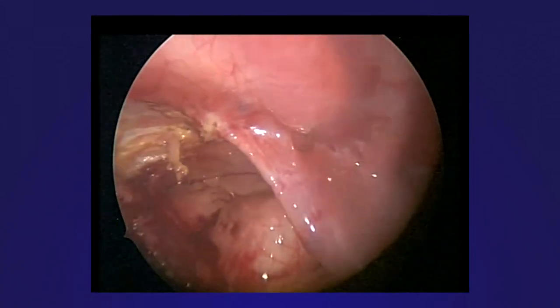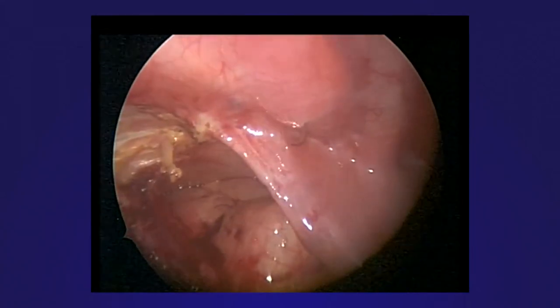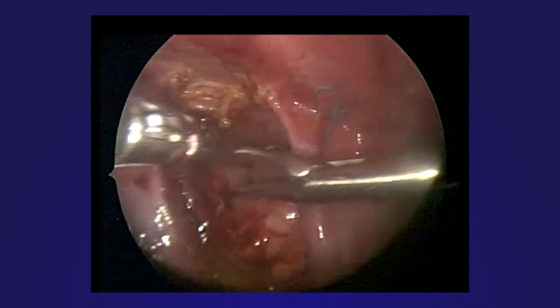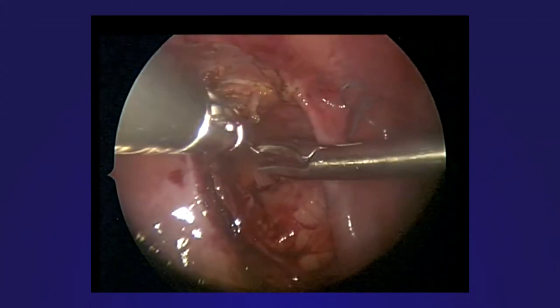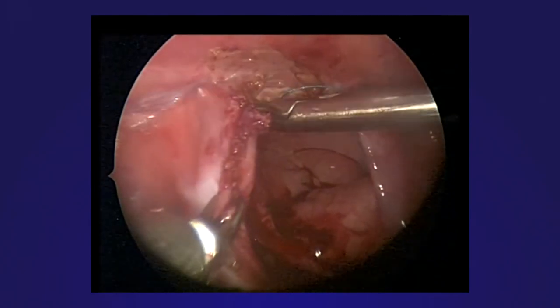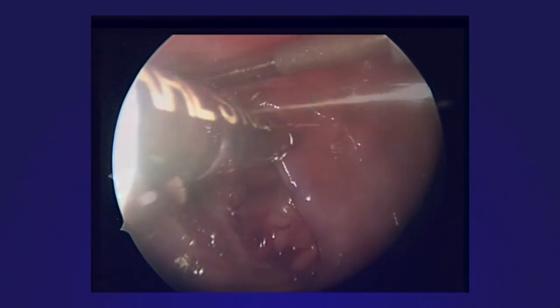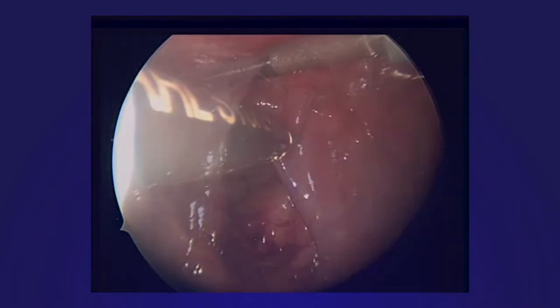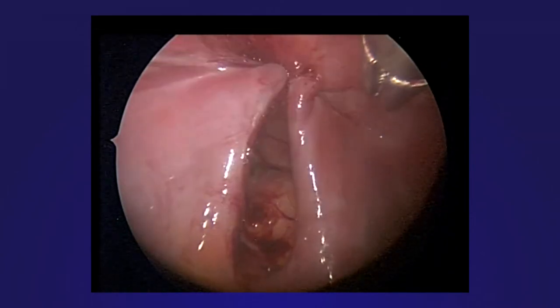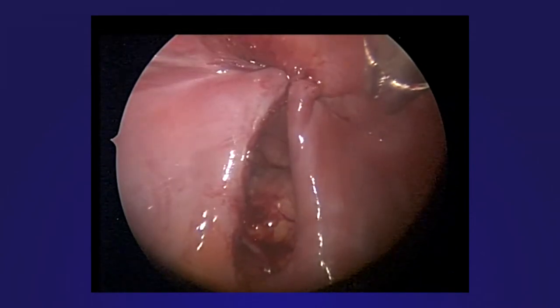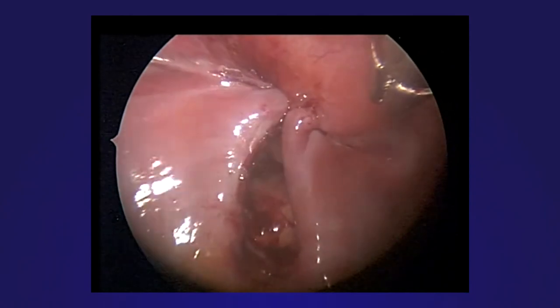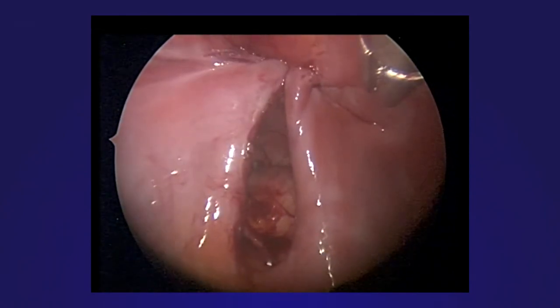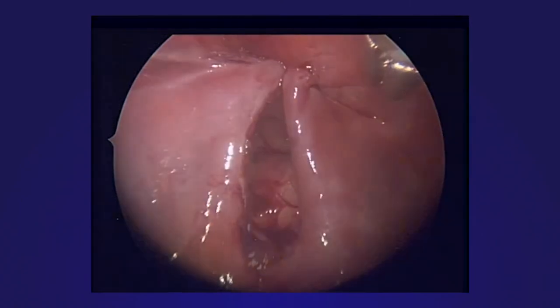The lateralmost stitch is placed first. The needle is introduced through the chest wall, takes a bite of the anterior rim, then a good bite of the posterior rim, exiting the chest wall on the inferior side of the same rib. The suture is tied extracorporeally after passing the needle back to the entry site. This anchors the lateral repair around the rib.